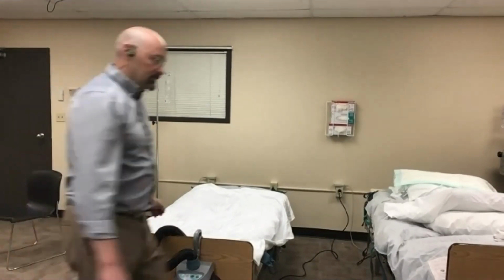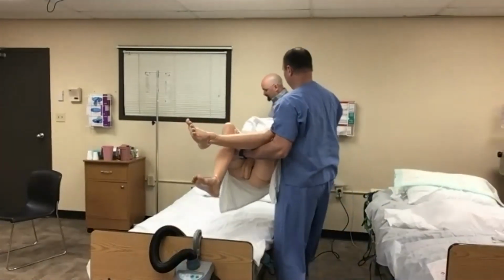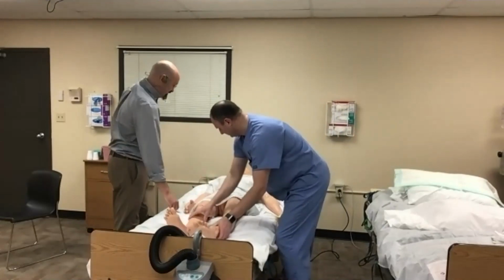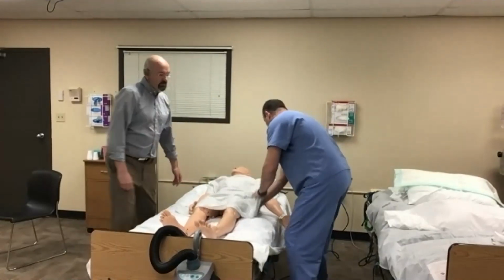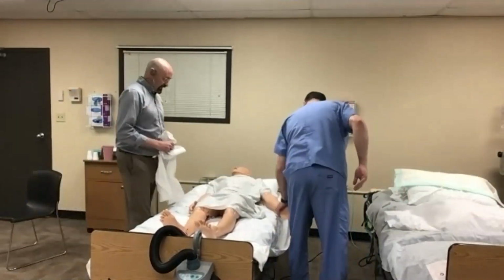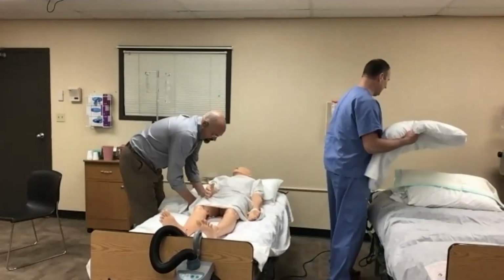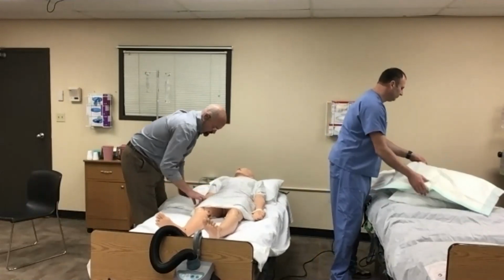Hello. All right, George. George, I need you to be comatose again. You're doing such a great job of that. And our pillowcase is there. Thank you, sir. We're still going to use the pillowcase technique. You're going to have this up at a good level to hold that patient in place.